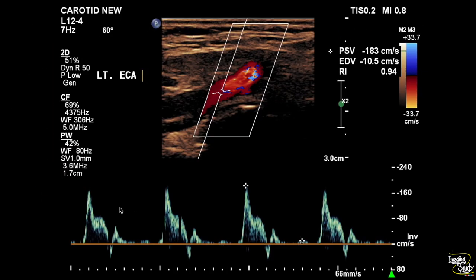Here's the left external carotid artery, and you can see the wave pattern looks quite similar to the left common carotid artery.